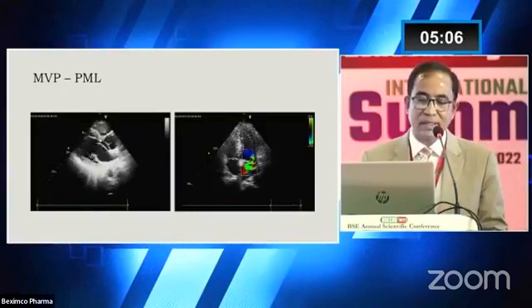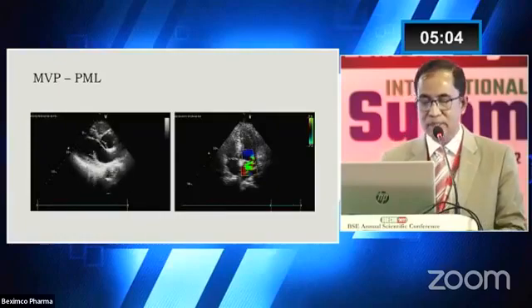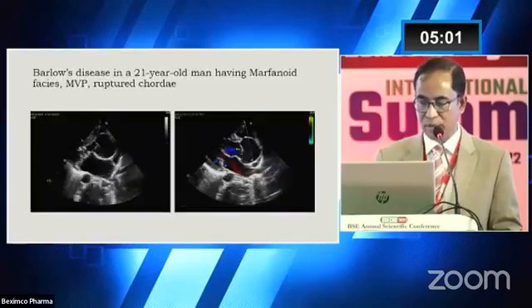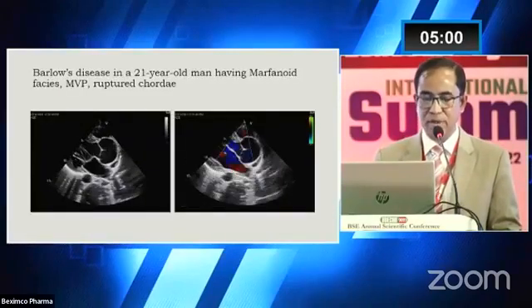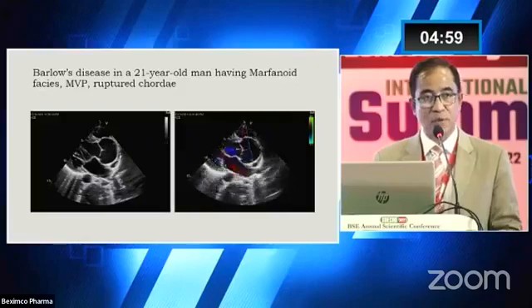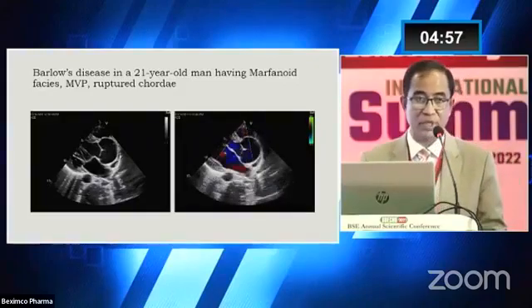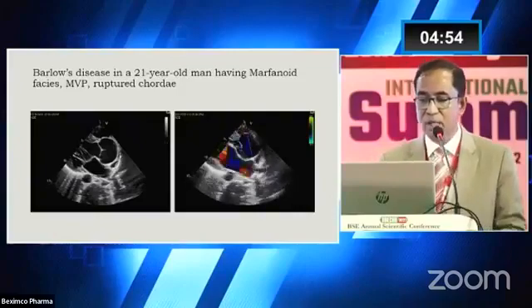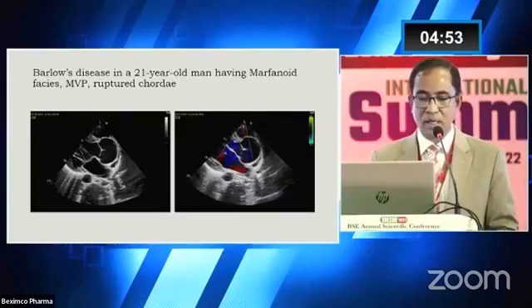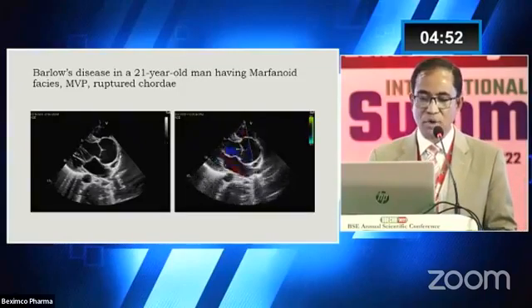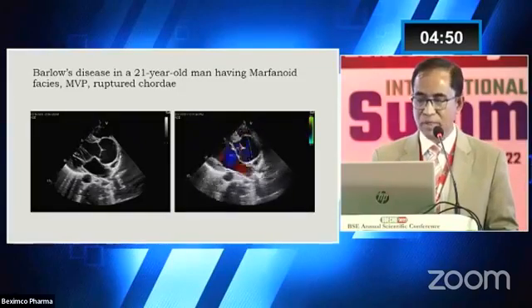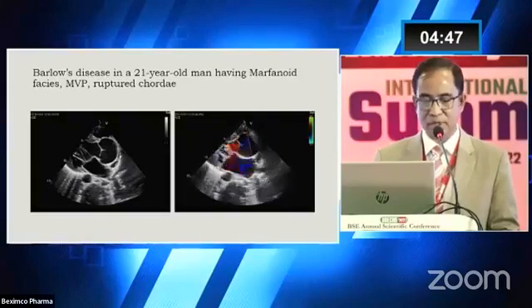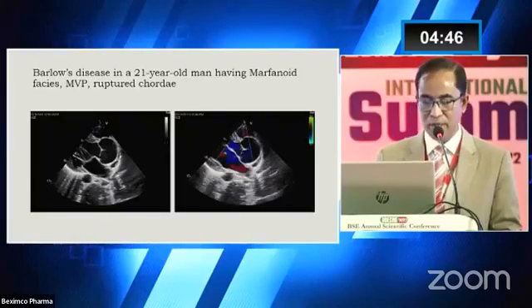Here is an example of mitral valve prolapse — you can see that the posterior mitral leaflet is prolapsing, leading to mitral regurgitation. This is probably an example of Barlow's disease in a patient with Marfan syndrome who is having severe mitral regurgitation. You can see the MR jet on the right side, and at the same time there is an aortic aneurysm.